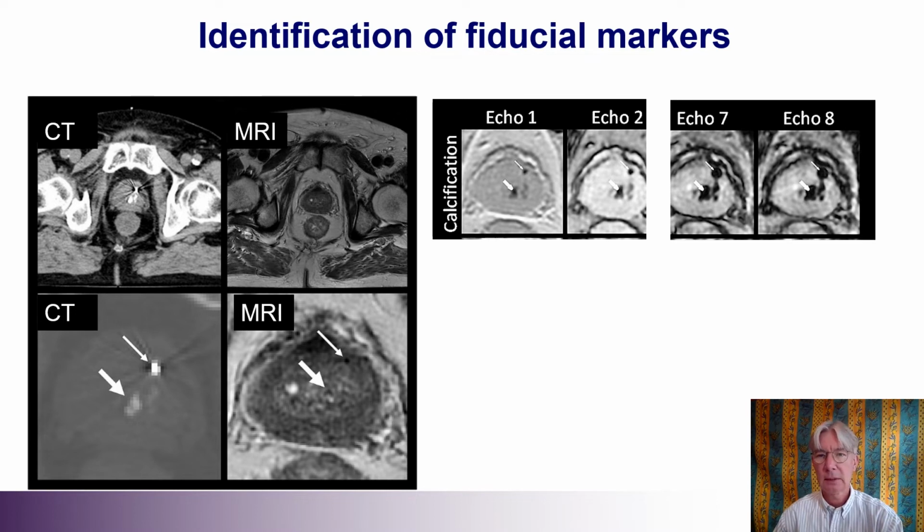And by studying this pattern, you can actually easily define the fiducial markers, but you can also differentiate the markers from the calcifications.